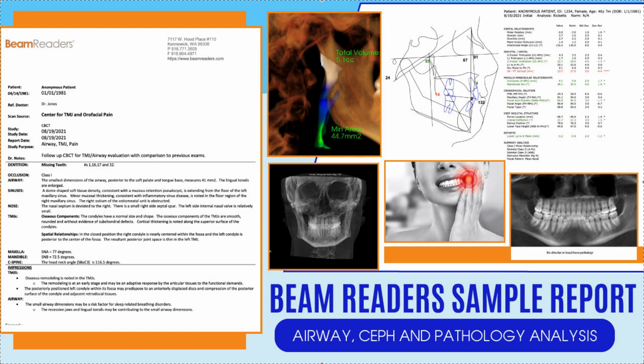Sometimes we can't move things forwards, right? But how would you know? Without this, you don't know. I don't have x-ray vision. Whenever I do an ortho case, I want to know that what I'm doing is going to help the patient, not only aesthetically, but also functionally and airway focused. Am I going to make things worse, or am I going to make things better? And without an evaluation like this, you do not know.